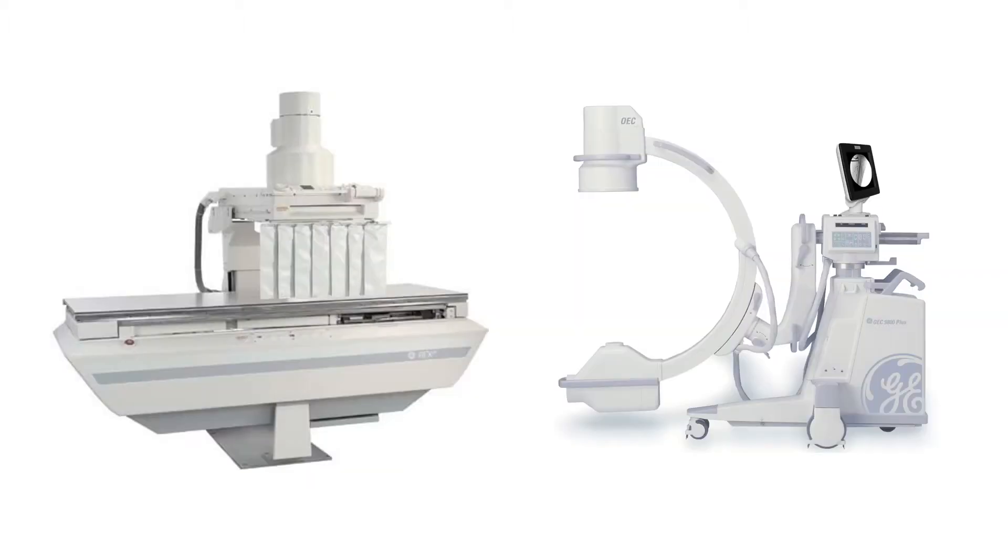The x-ray tube is usually hidden under the patient within the table. The image receptor is housed above the patient. As you move the image receptor, the tube underneath will move to stay aligned. There's no need to worry about detenting.